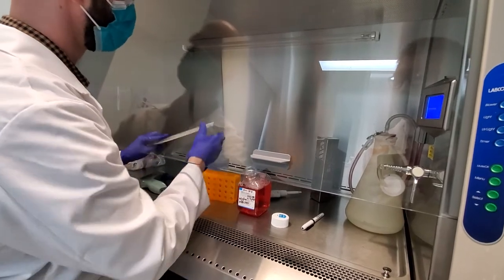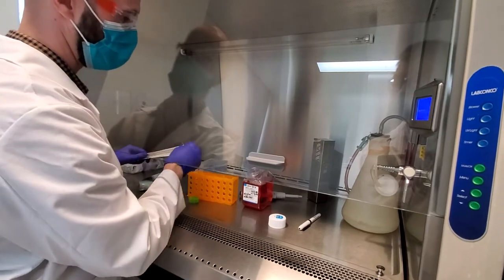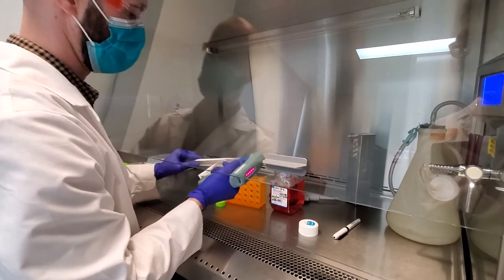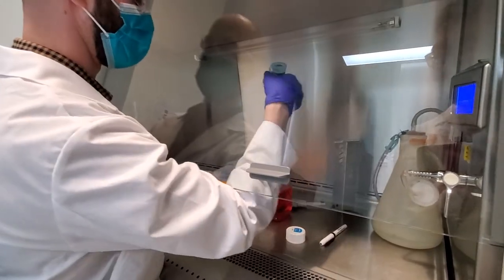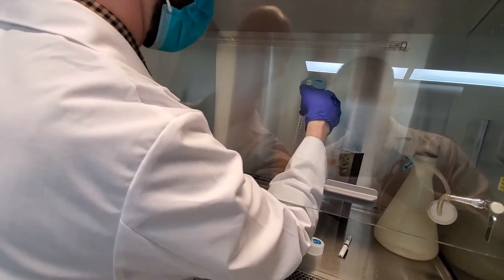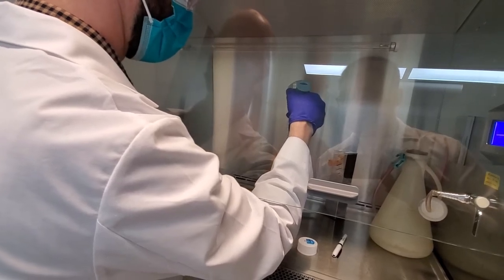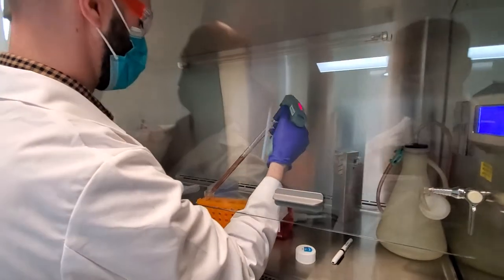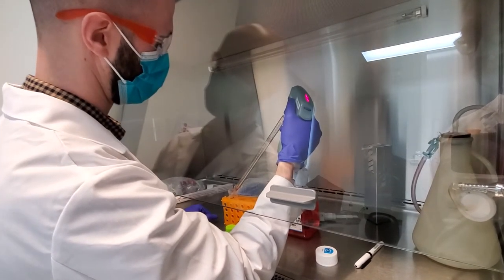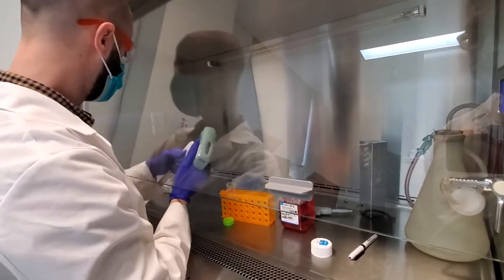So what we want to do, as soon as the cells are thawed in the cryo vial, is dilute it into media and dilute out the DMSO. So I'm going to do 20 mils here. If your cells are very sensitive, what you can do at that point is spin down this tube with the cells and everything in it, draw off that, and then add fresh media before plating. These 3T3 are pretty hardy, so I think diluting in this and then plating them right away should be okay. So I think that's what we're going to do today.